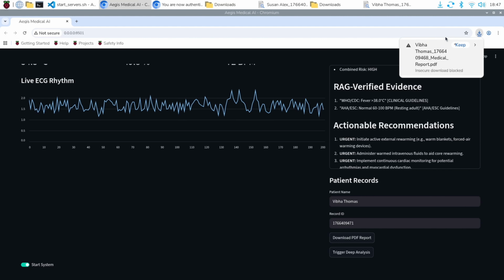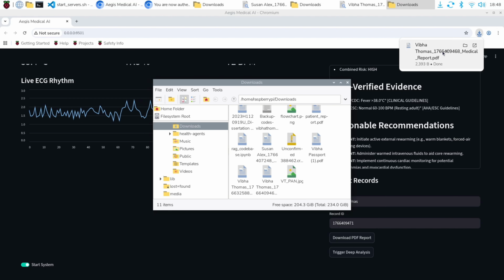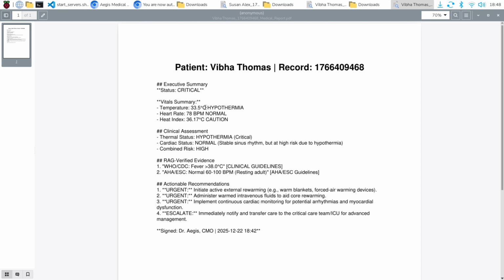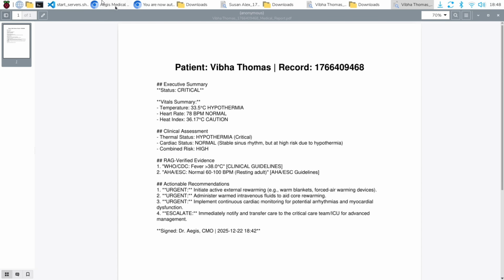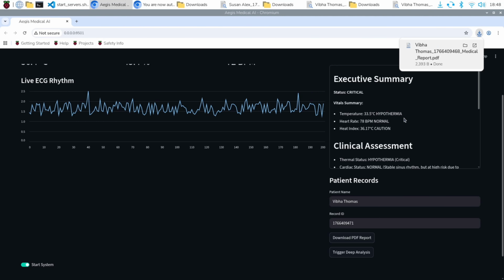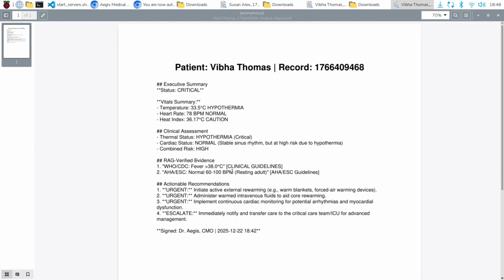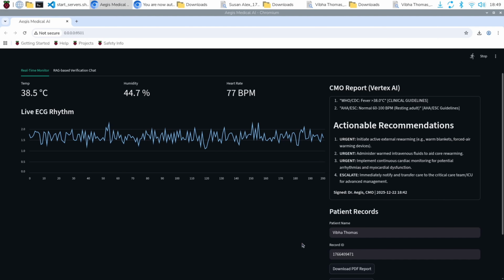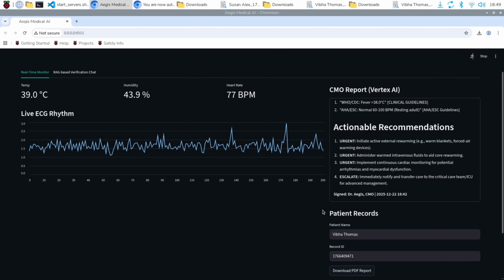Now you can download this. What I've implemented is that you can download the report from the edge itself. Whatever my agent on the device has processed, you can download as a PDF, which is shown here. And this one's the hypothermia one, just confirming it's 33.5, and the report also shows the same, which we triggered. And now we've increased the temperature to 39, which is pretty high.